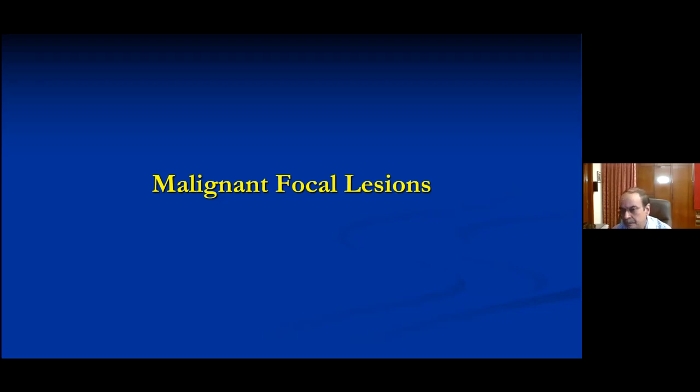Okay, this is Dr. Subhamoy Das from Kolkata, and he's asking about differentiating benign cystic lesions and the possibility of HCC on T1 imaging. So only on T1 you would not be able to do it. You would definitely need to inject contrast. As I said, a simple cystic lesion will show no contrast enhancement, whereas an HCC will show definite arterial phase enhancement. You definitely need contrast. I think that concept that we can give a diagnosis on MR without contrast is wrong. Whether it's CT or MR, you need to do a multi-phase contrast enhanced study with arterial, venous, and delayed images.